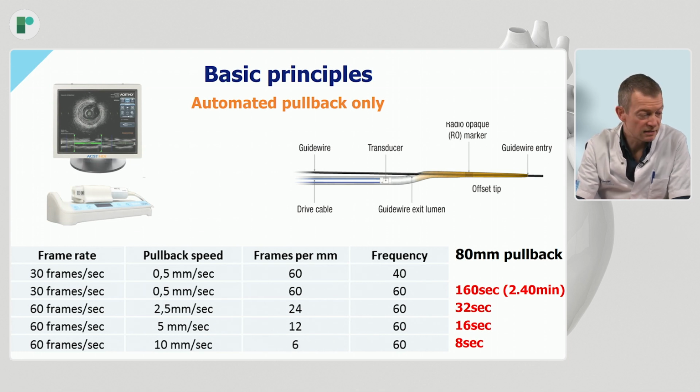So with that, I think it's time to go to the first IVUS pullback of the LAD. We have a console here of the ACIST Kodama HDi interface. In this case, we have multiple pullbacks that we can show you, but this is the pullback that started in the LAD.